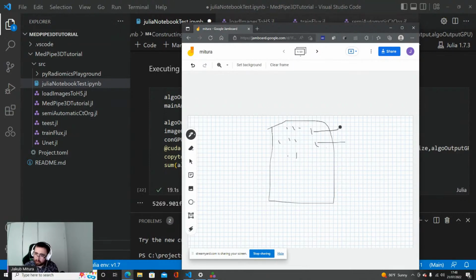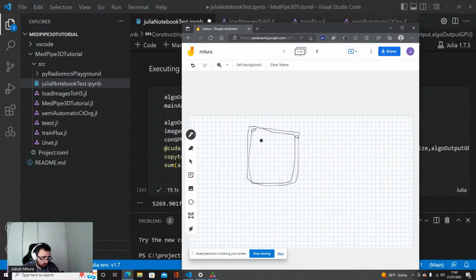That's why this data coalescence that we had described earlier was mentioned. And the other thing that is very important is communication between threads. So imagine that you have 1,000 people and you need to communicate with all of them at once, and to coordinate all of them. It's a hard task. That's why reduction tasks on the GPU are relatively hard. So what is the reduction task? The reduction task is that we have information from all of the spots and we want to get some single or reduced output from it.